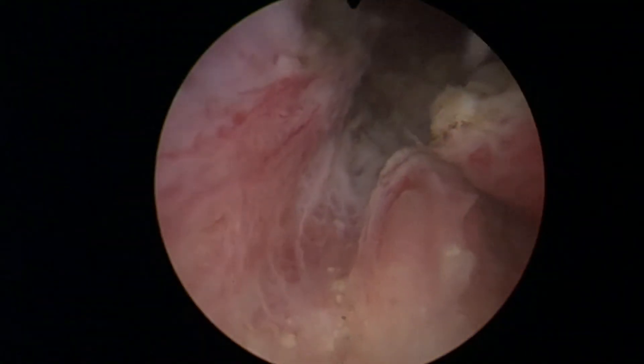I leave the most distal portion of the lateral lobe at the apex for later in the case, because I want to very precisely preserve the ejaculatory ducts in the appropriate patient. I also don't want to damage the sphincter and want to be very cautious there. Additionally, the blood supply to that region comes from the internal pudendal artery, so sometimes you can find a bleeder there that I don't want to waste time trying to control. At the end of the case, if you have a bleeder in that region, the prostate and catheter will take care of that.